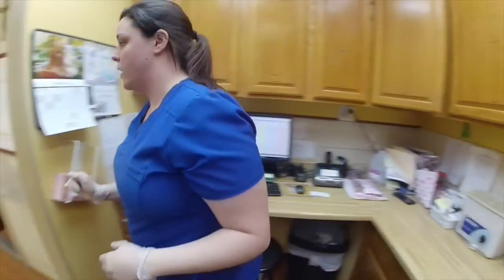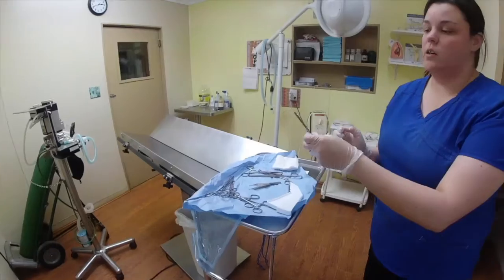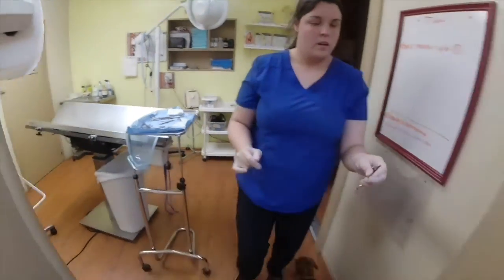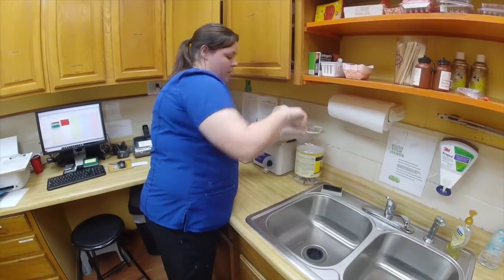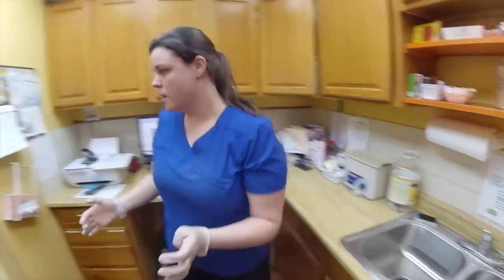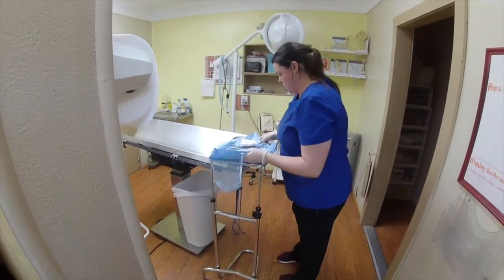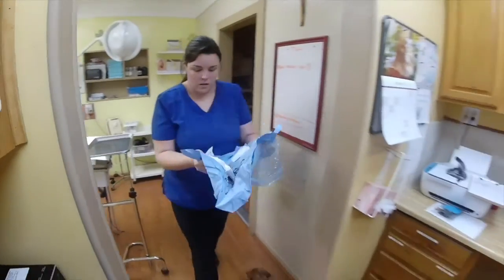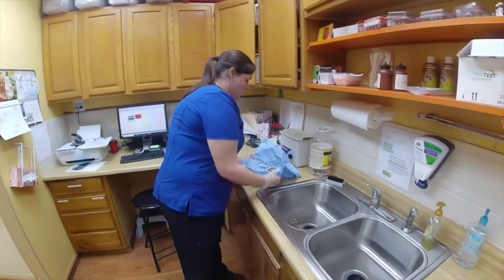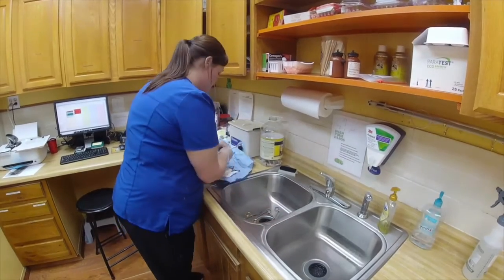Sideways so it'll fit up there. And then our suture material goes into a canister where we put all of our needles and suture material. And then the rest of the pack will come in here. And then all the instruments go into the sink whether the doctor uses them or not.